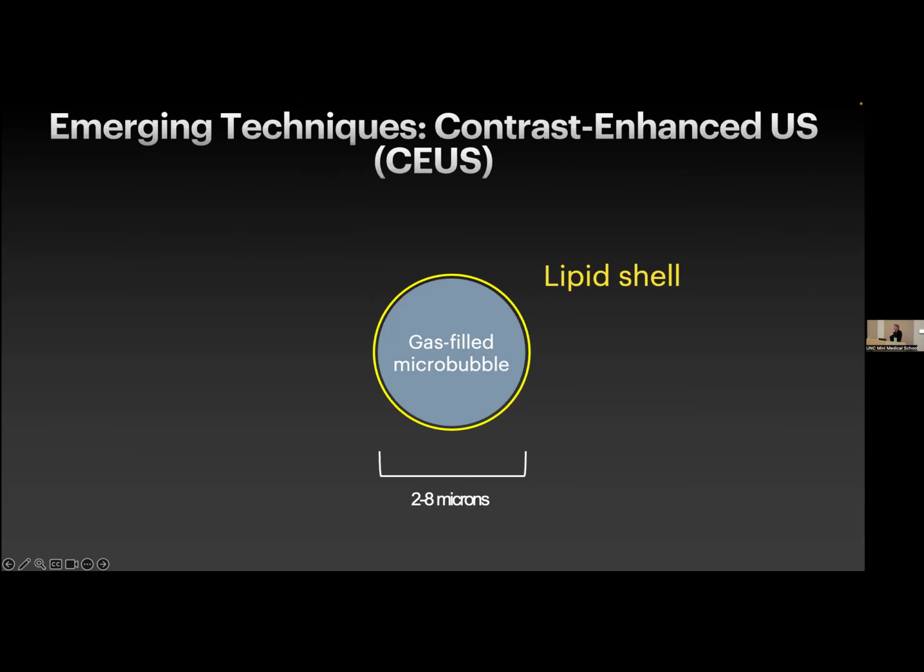So we can use this to help us identify, is there really truly significant blood flow? And is that going to mean that this thing that I'm seeing on ultrasound is more suspicious than if I didn't have any information about blood flow? So what we can use is a bubble that we put in through the vessel through a peripheral IV, and we can watch with ultrasound and we can see where those bubbles go, because wherever the bubbles go means that's where blood is flowing to.